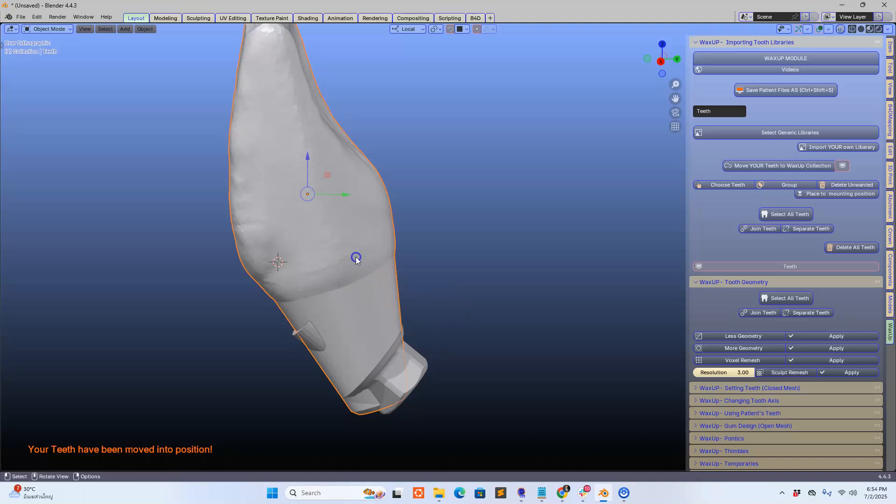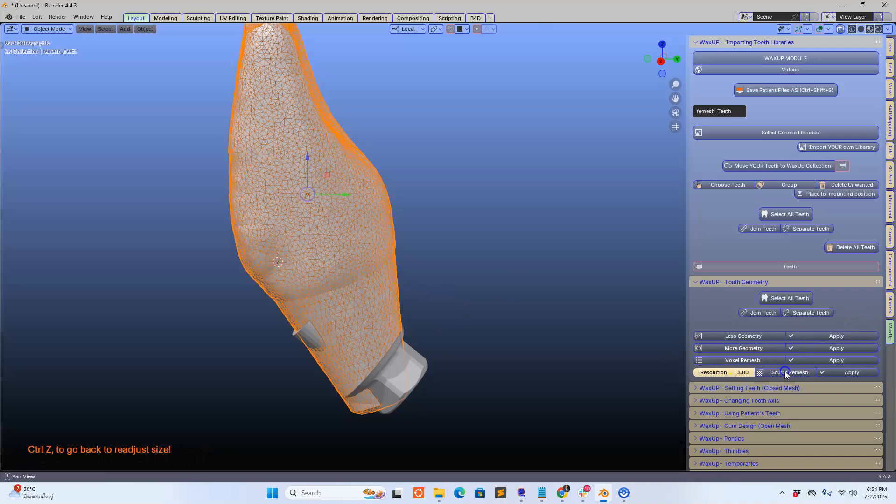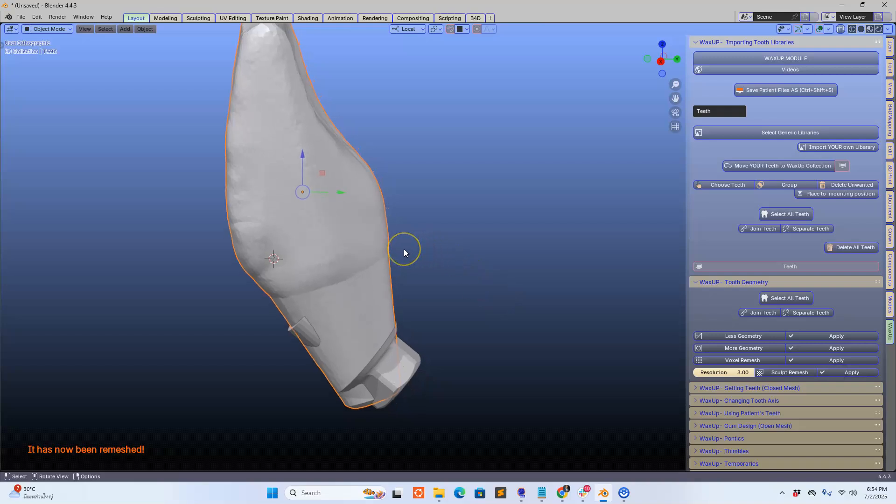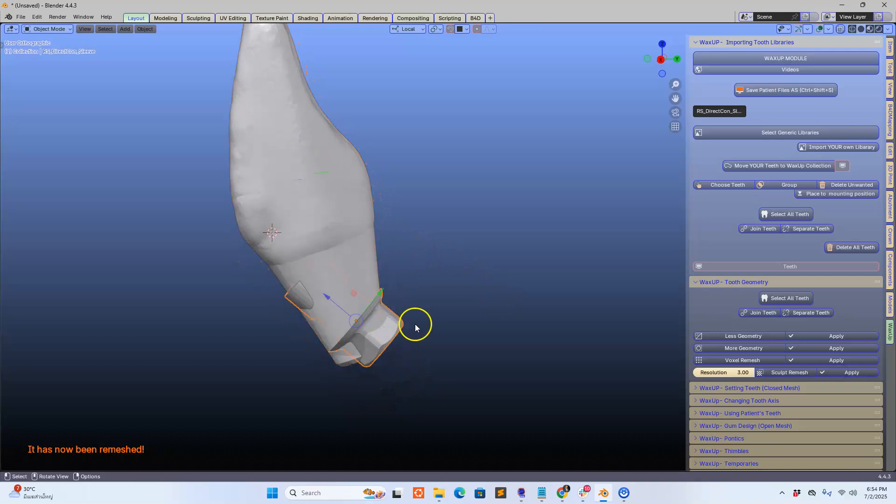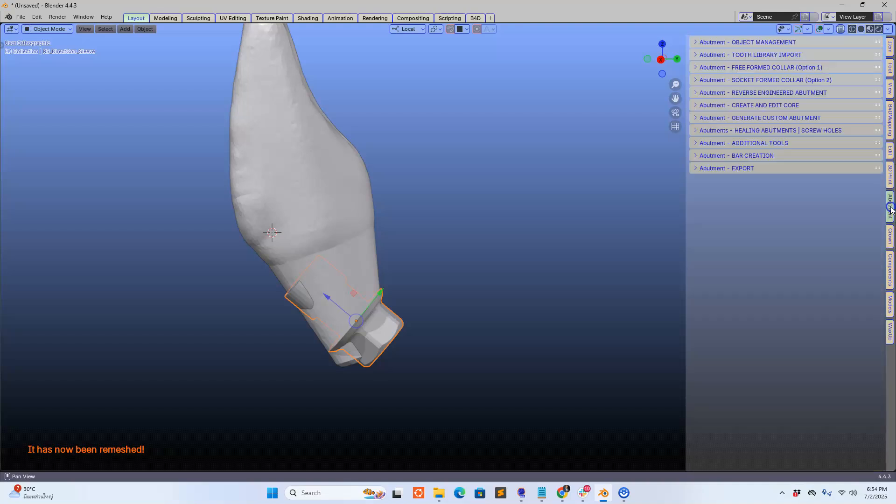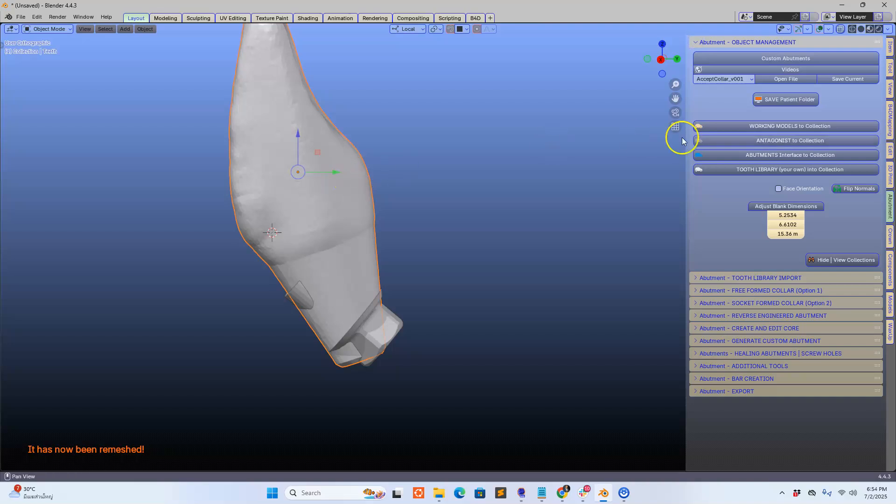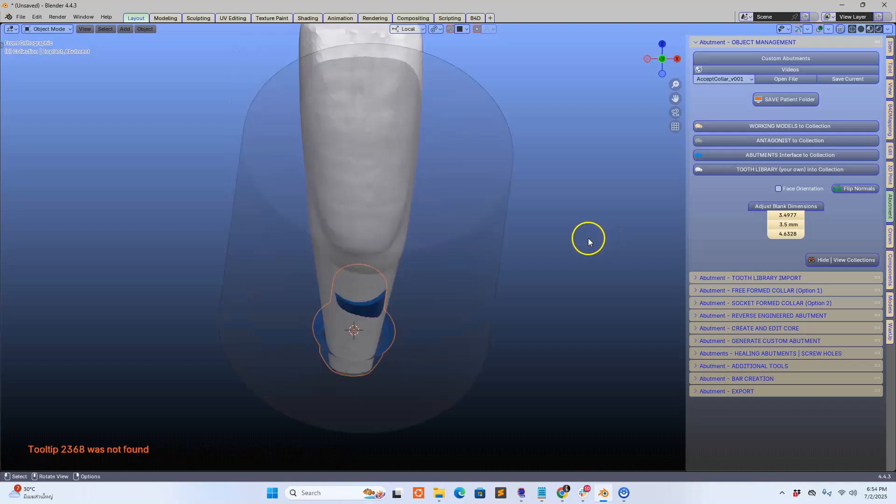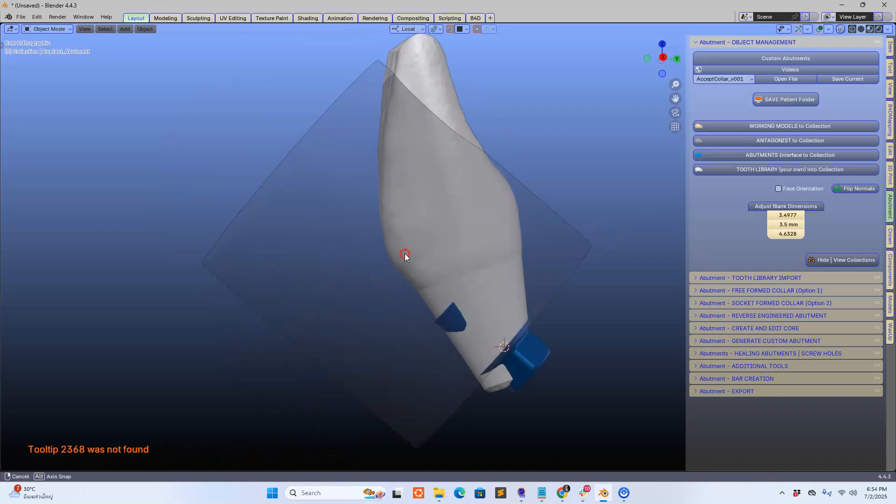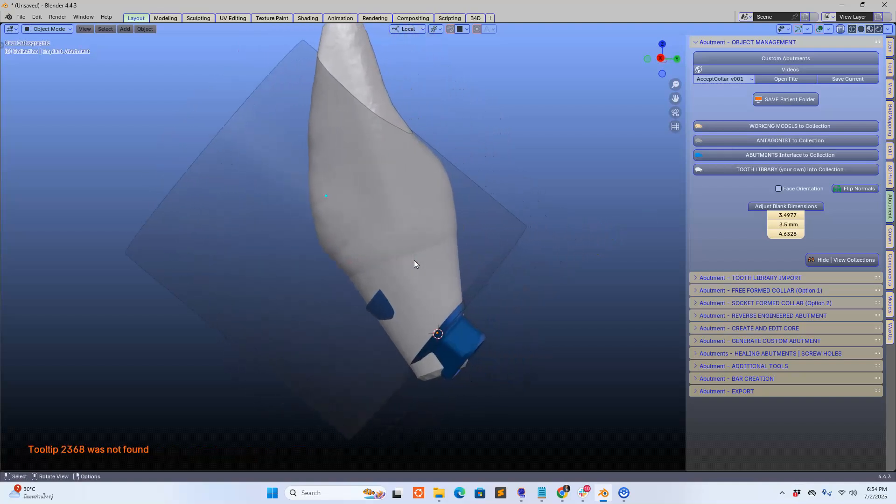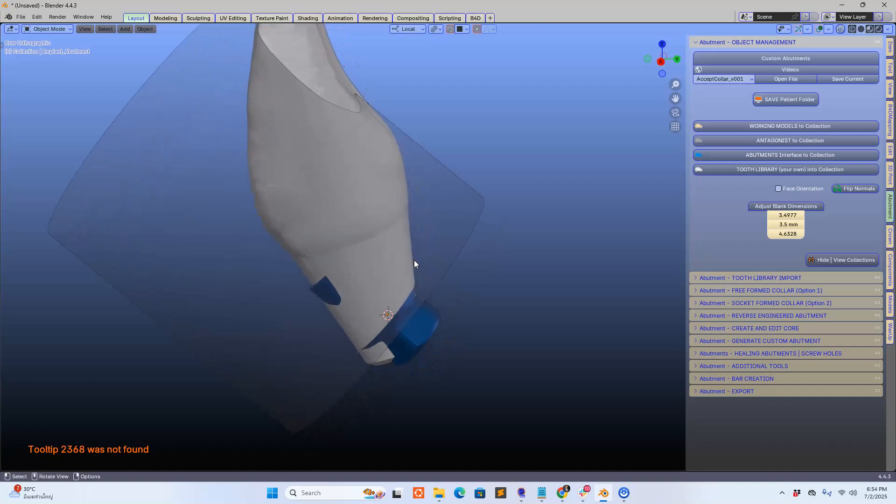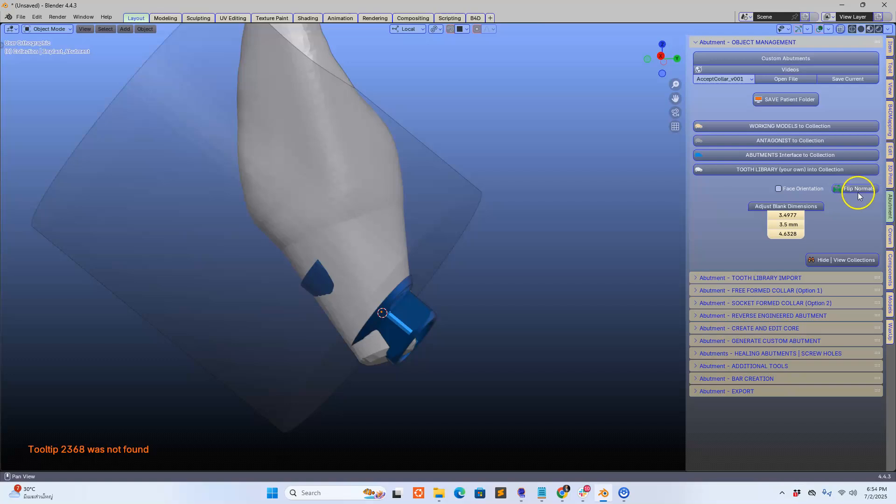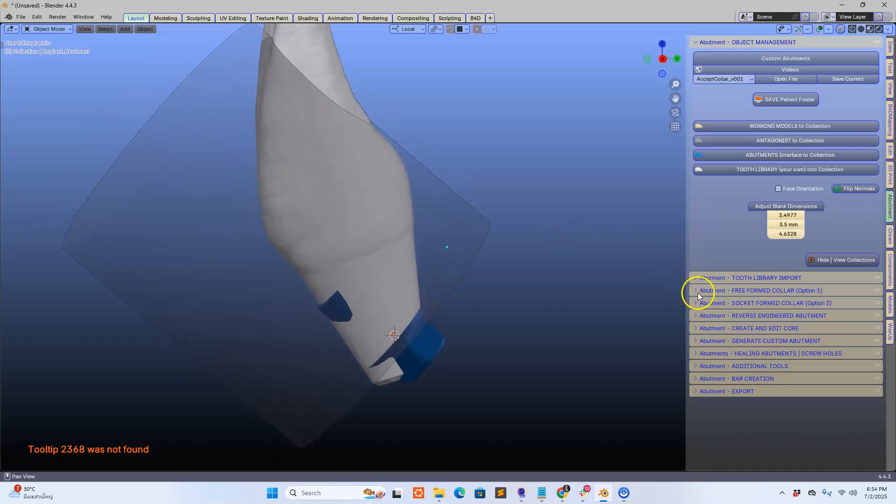So here we're going to remesh it because tooth libraries are all different and we need to standardize the mesh structure. In the abutment module we're going to do some object management. This is my tooth and this is my abutment. Always make sure that this blank is facing in the correct direction. If it's not, it means your normals were flipped and you can flip the normals over here. In this case everything is working well so far.